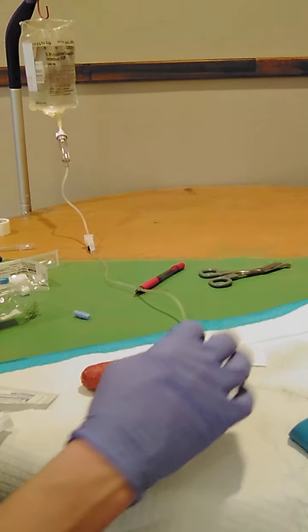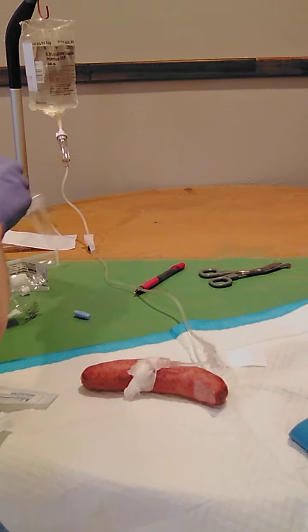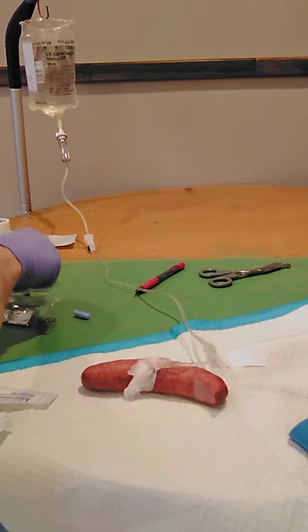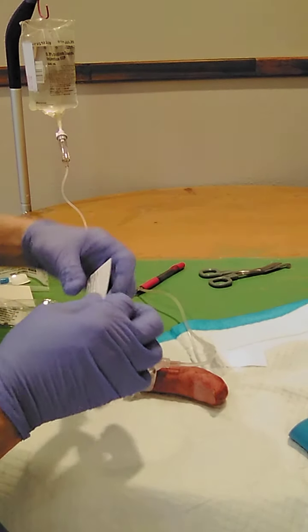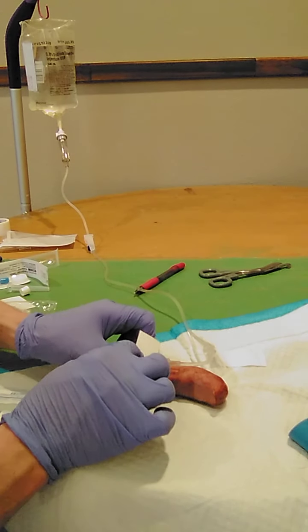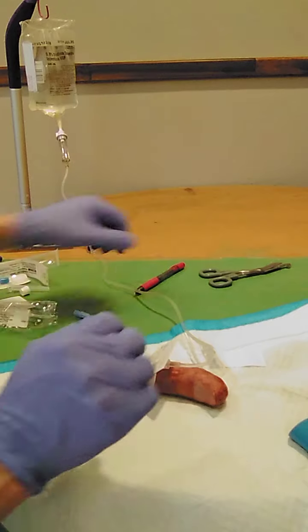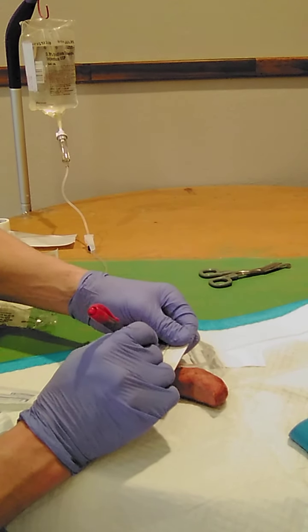Okay, that's looking quite good. Now, I just need to get my sure site. So, with having that not covering that joint, I can now date, initial, and write when this infusion began.